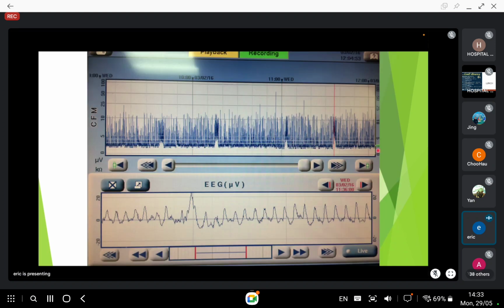Okay. This one. Who wants to try? The last one. Assuming that the impedance is good also. I can try, doctor. Yeah, sure. This is severely abnormal. Would you like to describe the background? The lower margin is less than 5. Okay. And the upper margin is less than 10. Okay. Where is the upper margin? Do you think the upper margin is here or this one? I think the upper margin should be where the pointer you are showing is. Yeah. Around there. Yeah, that's correct.